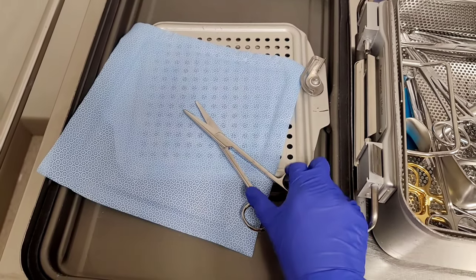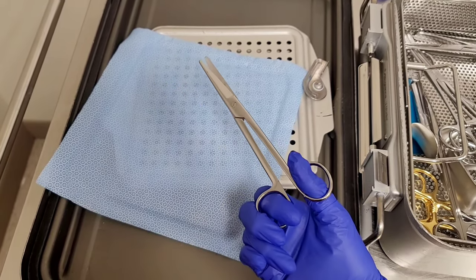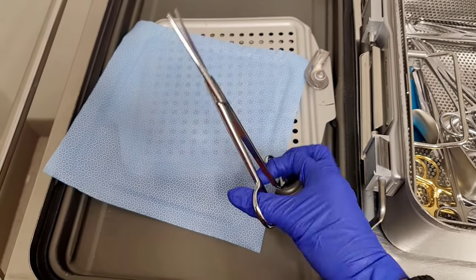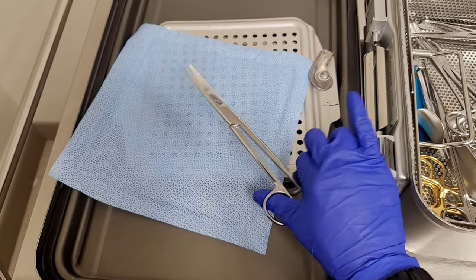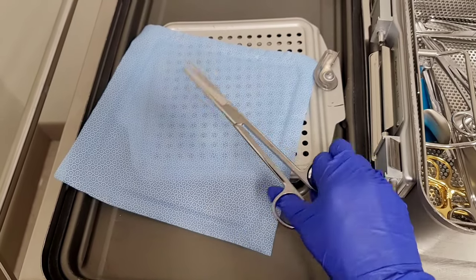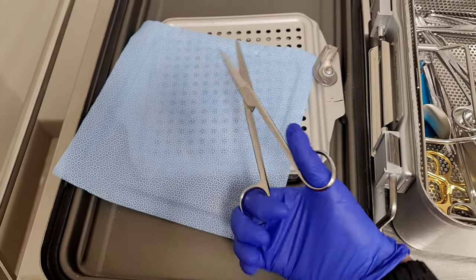The first method is how a lot of scrub techs and residents like to hold it — like this. This is very uncomfortable. There's no control here and it kind of hurts. This scissor is not very fluid and this grip is not comfortable on your hands. So this is the first one — don't do it like this.